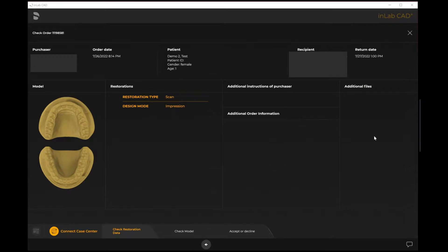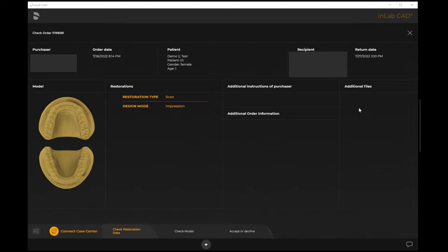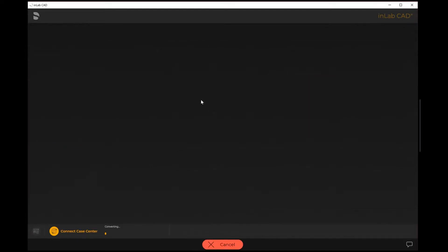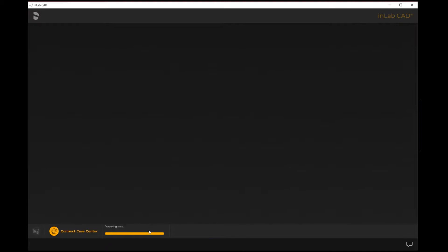Additionally, if they were to attach items like pictures, JPEGs, PDFs, whatever it might be, any additional files that they've attached to this particular case will show up here under additional files. If we want to check the model, this means that we can check the impressions themselves. The converting option here on the bottom is just based on internet speed.